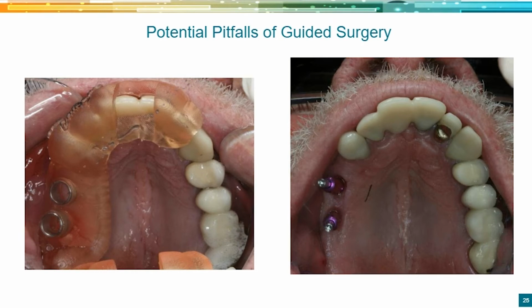I did just 2 custom abutments and a bridge, but obviously a lot more expensive, and had to use cement and all that kind of stuff to restore it. So be mindful of that, just constantly checking.